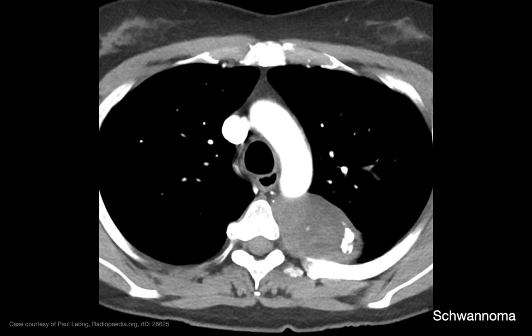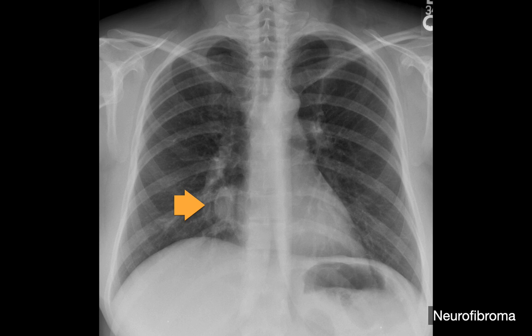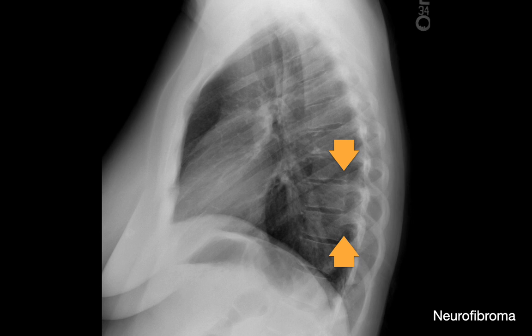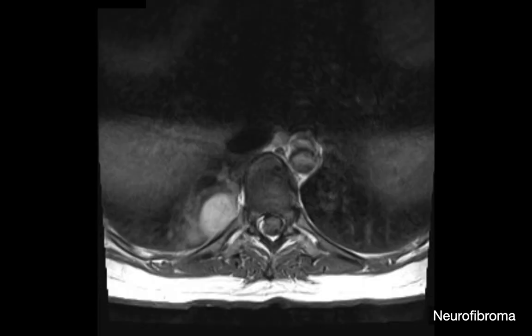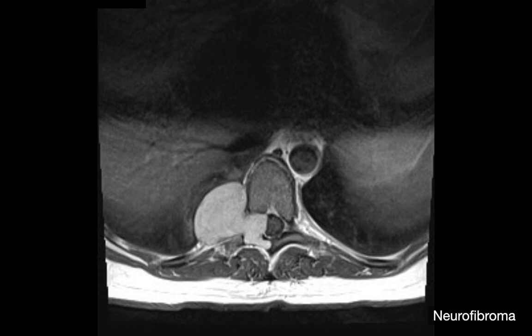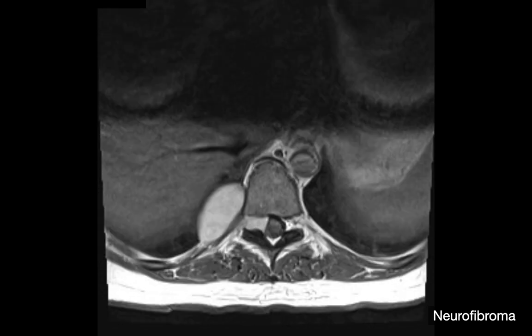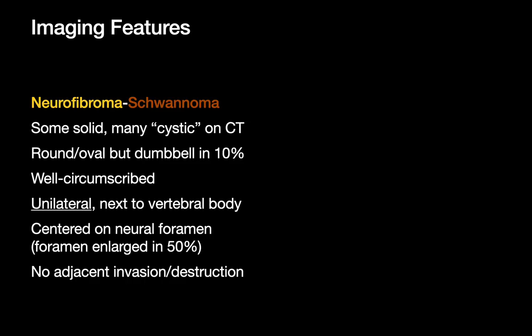This is a nice example of a schwannoma presenting as a posterior mediastinal mass — it's oval, well-circumscribed, and unilateral. Here's an example of a neurofibroma on chest X-ray, visible on the frontal view and better appreciated on the coronal MPRs from chest CT, showing a mass of the posterior mediastinum crossing a neuroforamen. The MR images illustrate a dumbbell-shaped, well-circumscribed mass — typical imaging features of a neurofibroma or schwannoma.